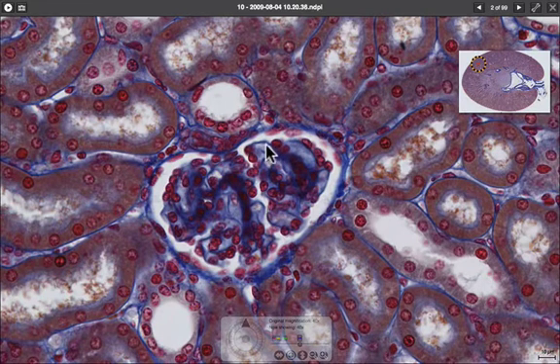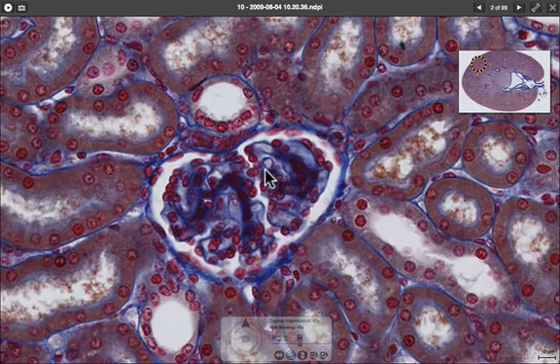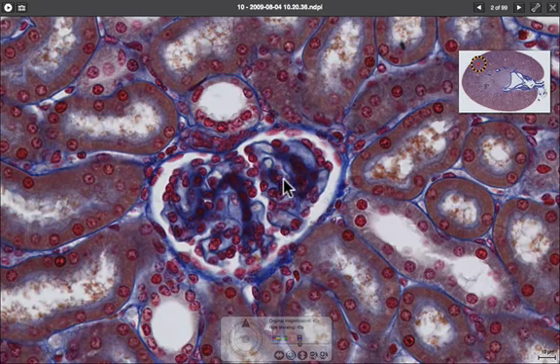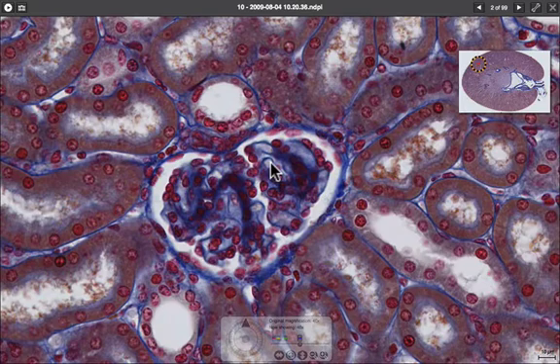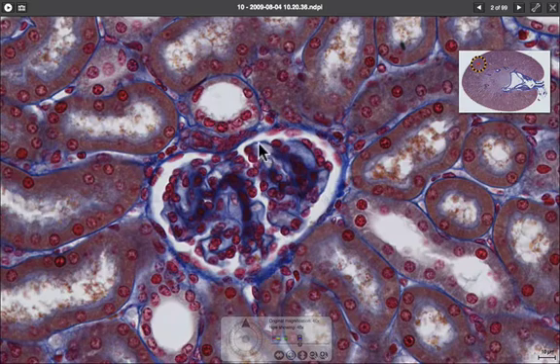The capillaries themselves you can see in cross-section here — here's one, here's another. You can see the detail of them held together by the mesangium, and the kidney filter itself is really across this line here.